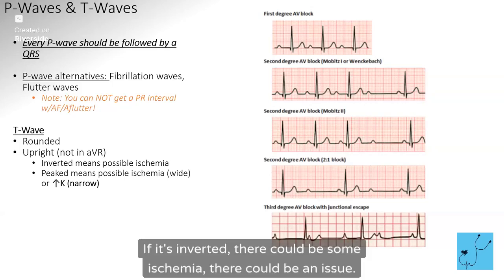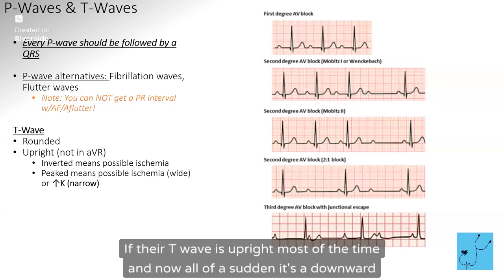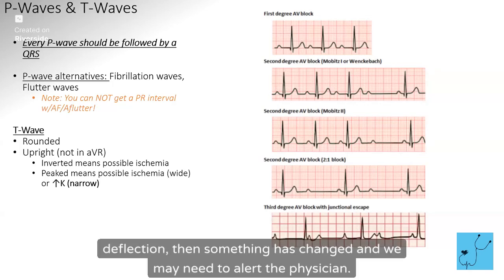Our T wave should be rounded and upright. If it's inverted, there could be some ischemia, there could be an issue. A lot of patients just always have an inverted T wave, so it's more about a change in the rhythm. If their T wave is upright most of the time and now all of a sudden it's a downward deflection, then something has changed, and we may need to alert the physician.